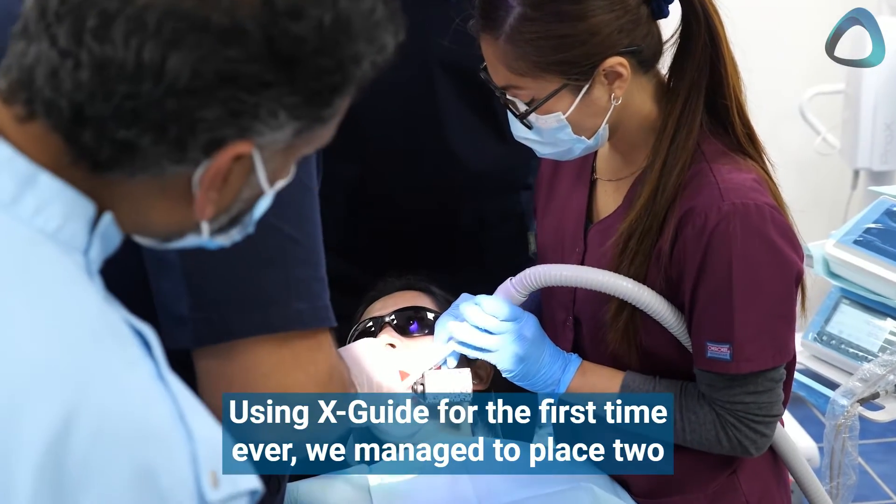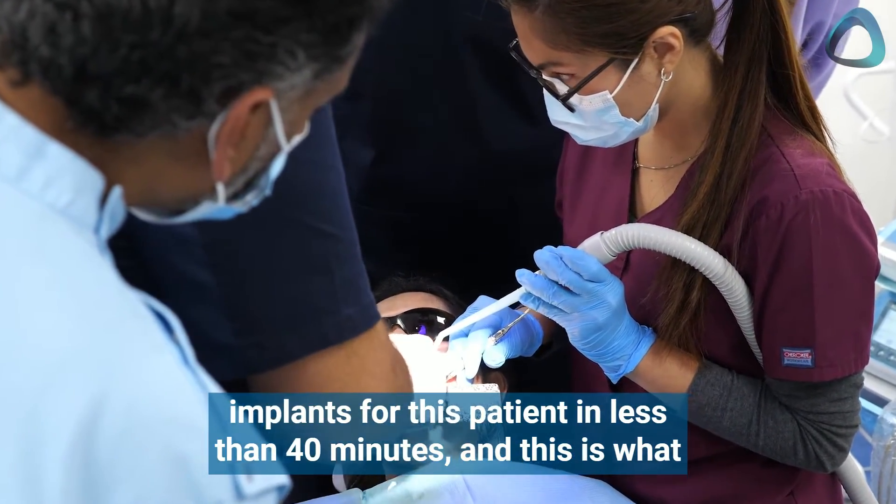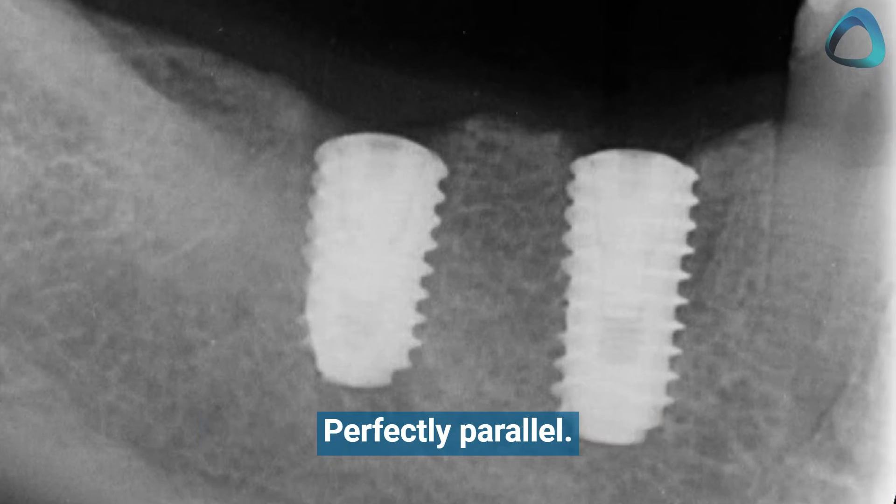Using the XGuide for the first time ever, we managed to place two implants for this patient in less than 40 minutes. And this is what the post-operative X-ray looks like — perfectly parallel.